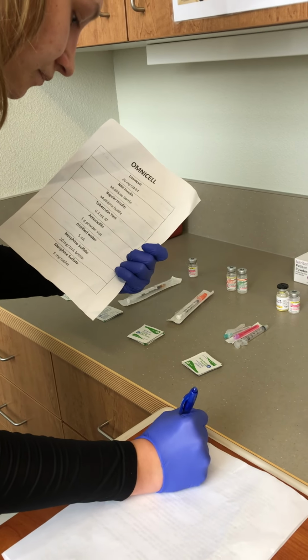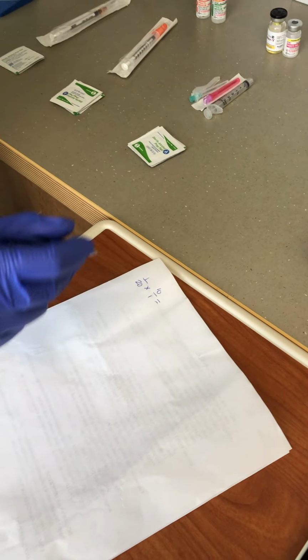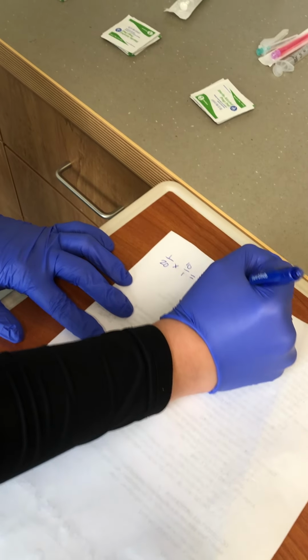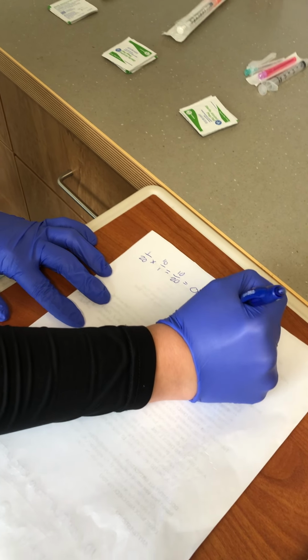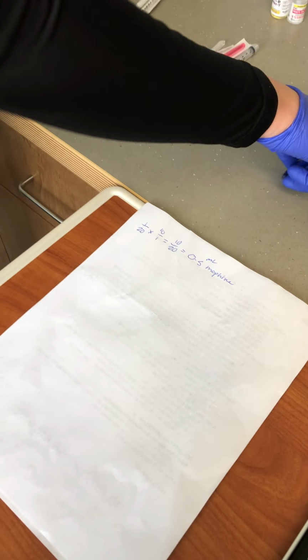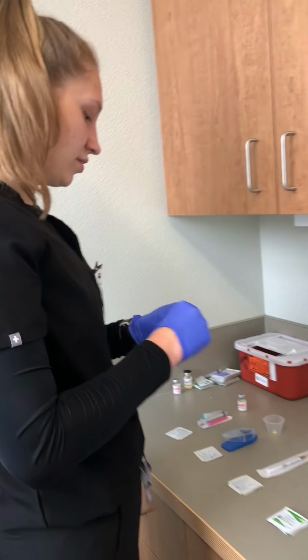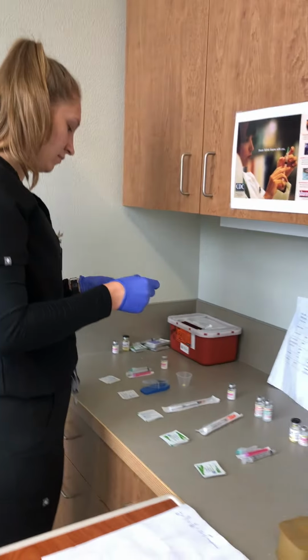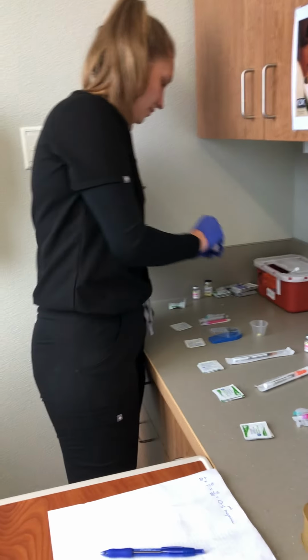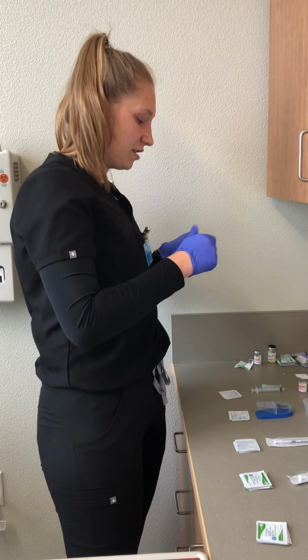So I'm going to go 1 over 20 times 10 over 1, and that gives me 10 over 20, which is equal to 0.5 morphine, and that's going to be milliliters. So that's what I'm going to go ahead and draw up on here. I'm going to take my cotton swab and wipe this all clean. I do this for 15 seconds. I'll leave that there. Now I'm going to take my filter needle here.